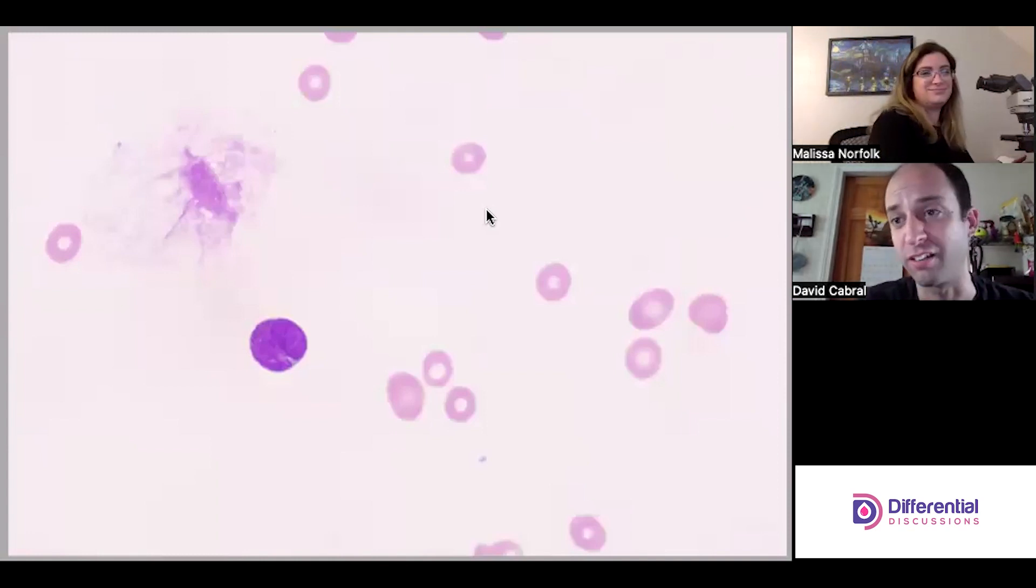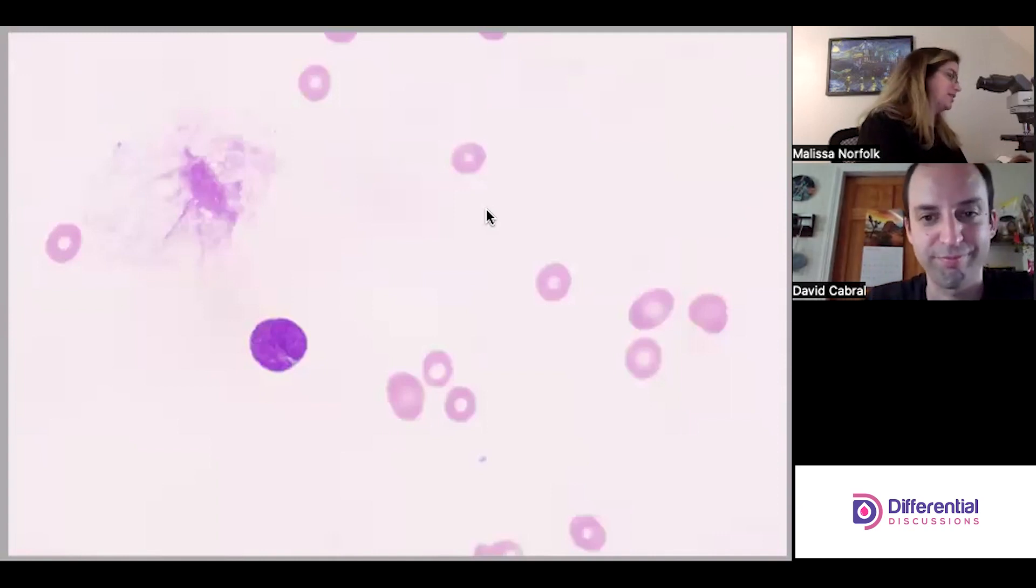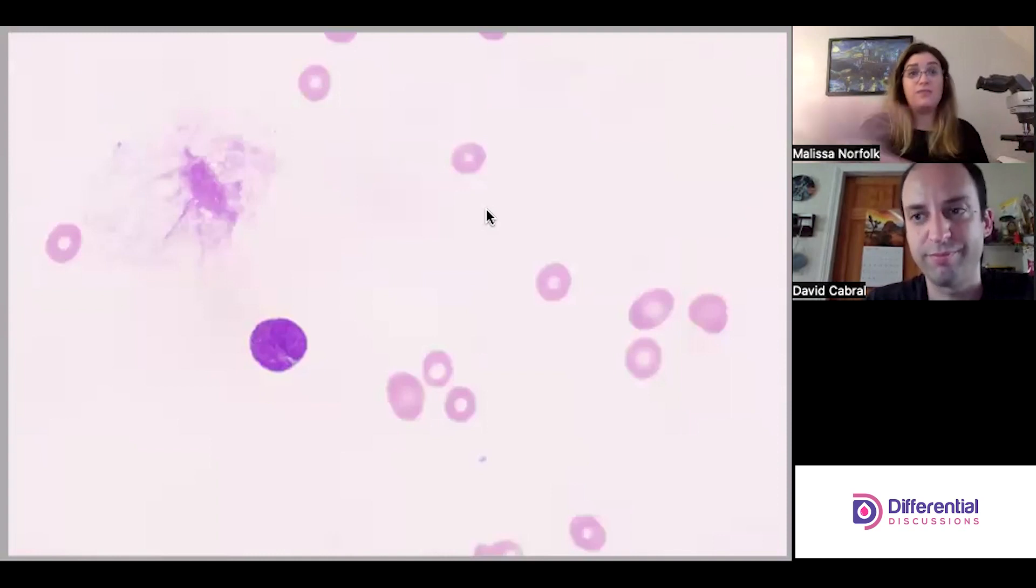I'm going to talk about the red cells again. One, two, three, four. You can't normally comfortably count red cells. This is insane. It's not like you're in a thin area. I can tell that these red cells are in a great area for you to do morph on and they're just, there's none of them. That's how we can tell this patient is super anemic and super thrombocytopenic. If this is a field that you showed me, you could safely say this is an acute leukemia because of the anemia and thrombocytopenia, because you don't usually get to that degree with chronics. Chronics usually have really elevated whites, so even if you don't have a lot of reds you're going to have a lot of whites, the leukemic whites.